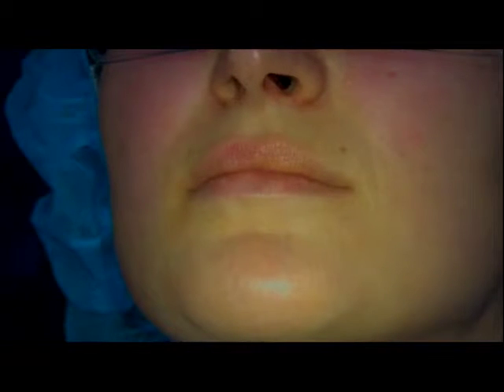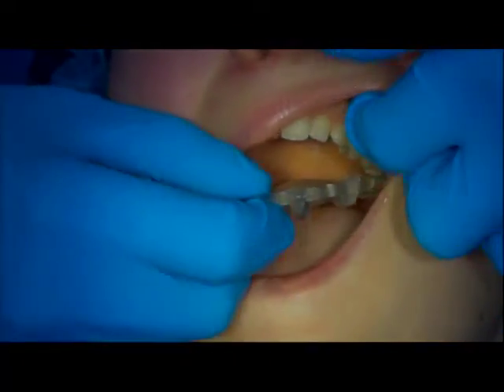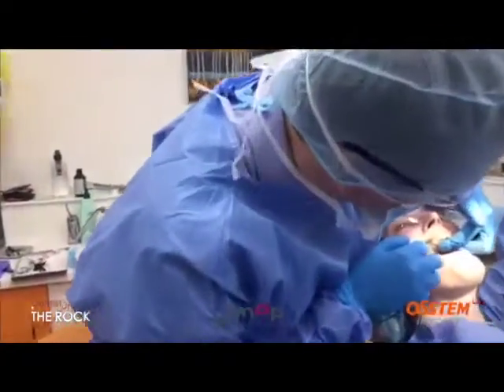The first thing I'm going to do, I'm taking the drill guide, and I've already checked this before we numbed up the patient, but I'm checking that it's the fit that I've asked the lab to create.